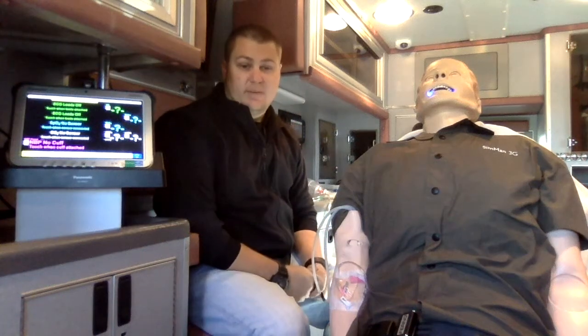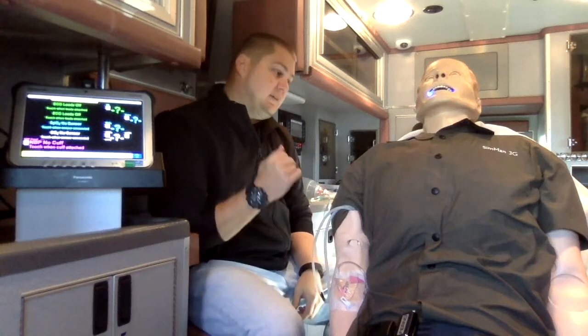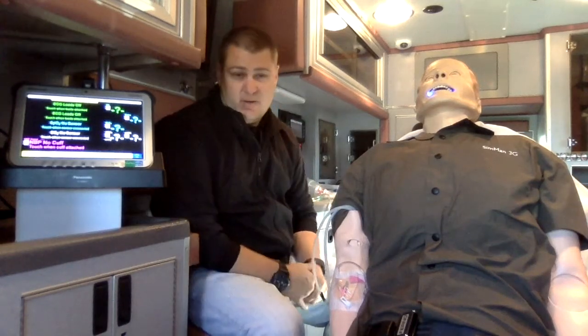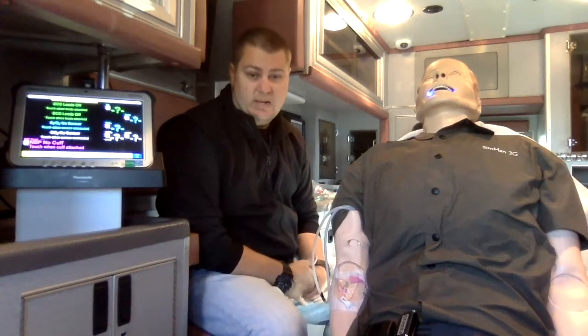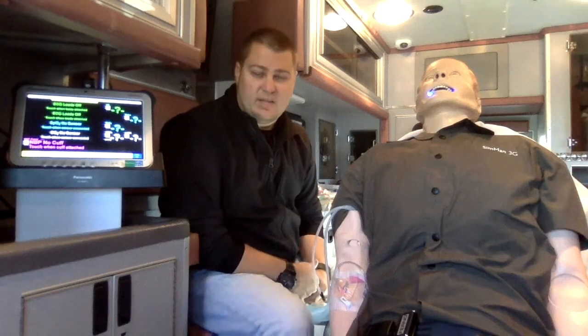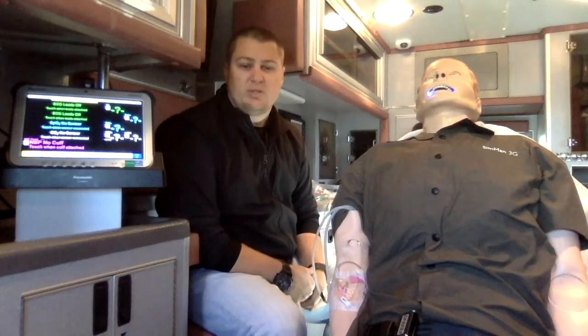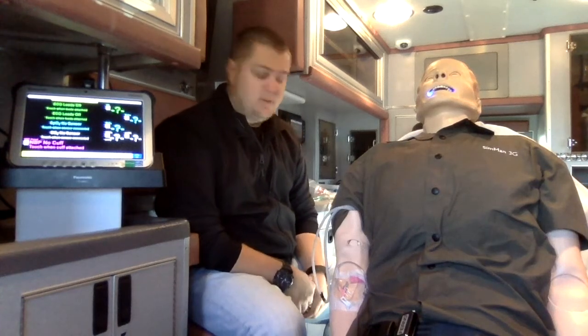All right, today's topic again, airway failure or pending airway failure. In this scenario, we're going to use the same scenario I used in the last video, but we're going to do some different techniques and different ideas. Maybe challenge your system or challenge your guys' ideas of some things that you can use that maybe are non-conventional, but maybe might be a little more appropriate, a little more beneficial for your patient.